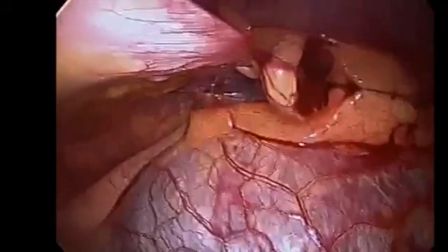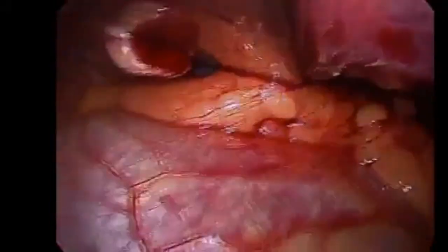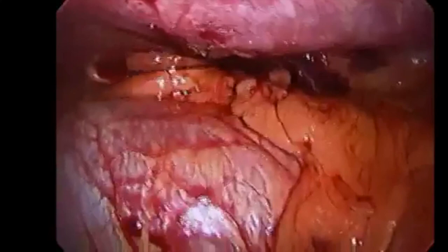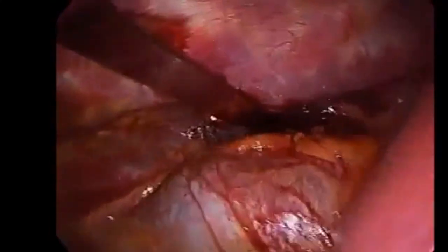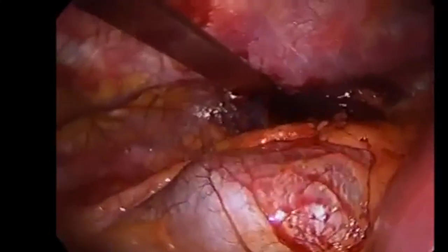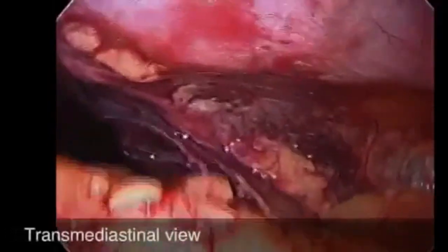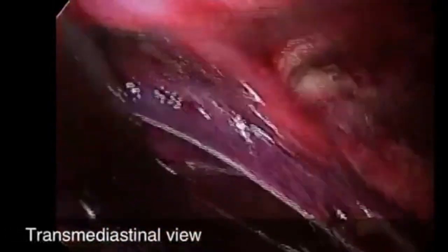An internal view of the corrected defect can be seen here. Careful inspection for bleeding at the bar entry and exit sites is performed. The bar can be seen easily passing through with no bleeding.